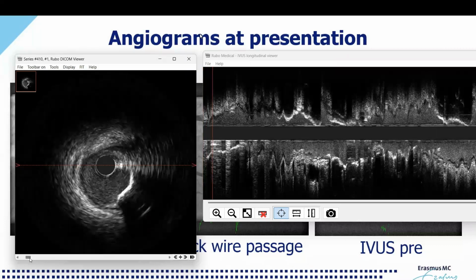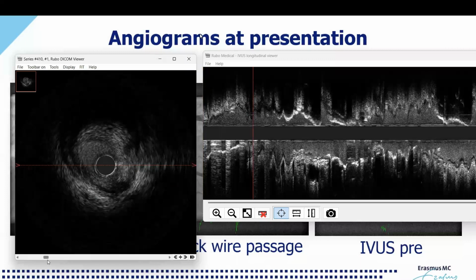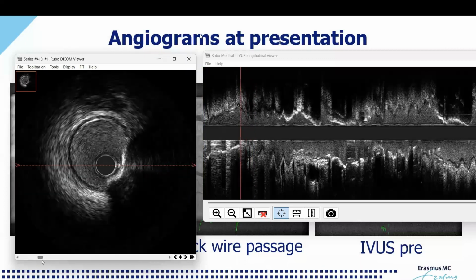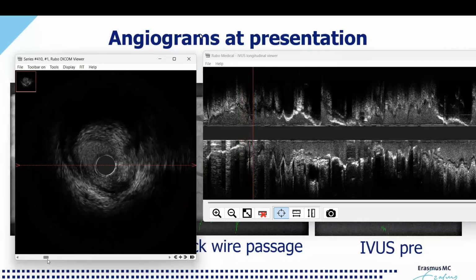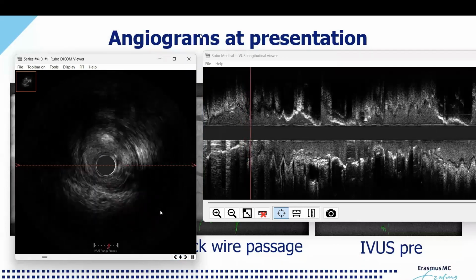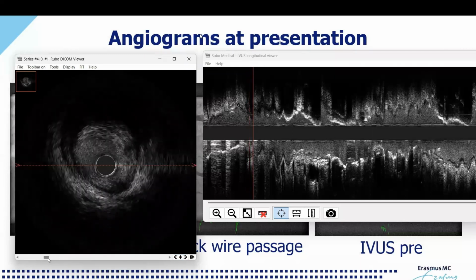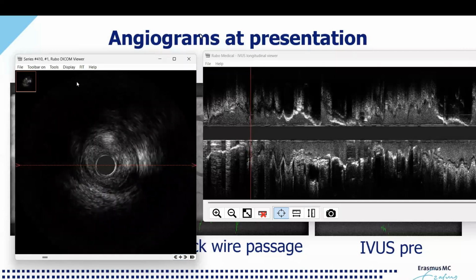And then we move up, and we are particularly curious for the stent, but not after we've seen this. Here we have a region where I think we have some migration of thrombus to this spot. Here we have a minimal luminal area. I will immediately measure that for you.